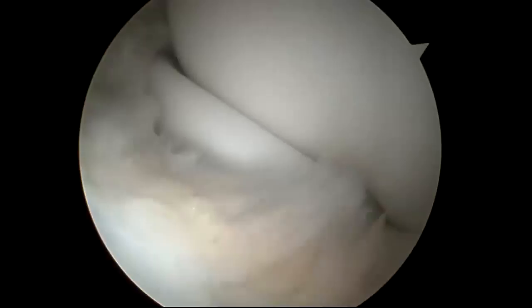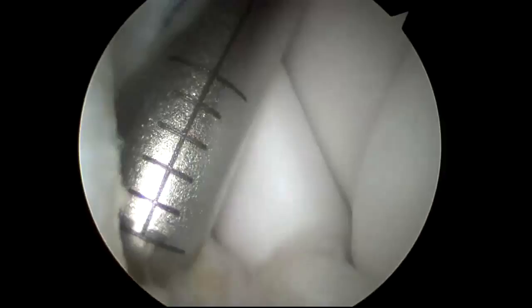Arthroscopic plica excision. This patient has pain in the elbow along with popping and clicking with motion due to plica.